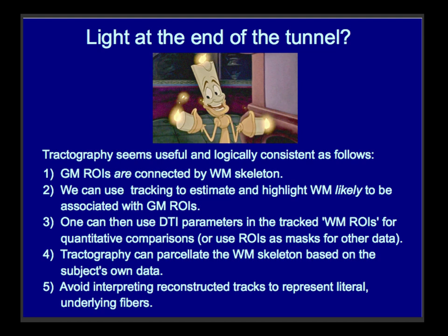And now and forevermore, please don't think of these as literal connections, but really as probabilistic things, like, I think that the structures are mostly going like this. And so if I see 10 of them in one brain and 20 in another brain, I'm not thinking that this person's brain is a lot more tightly wired than person A's, it's just a probabilistic sense within the person's brain.